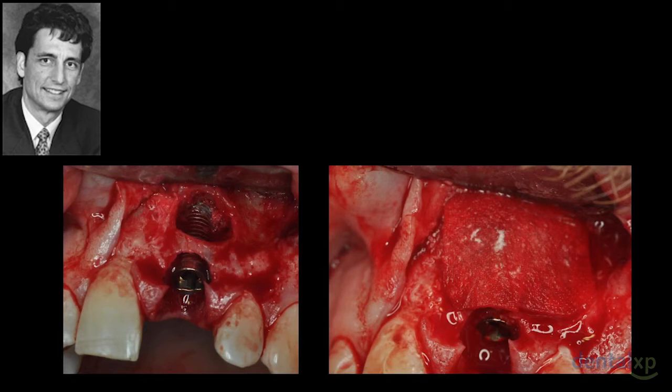It is also feasible to try to tunnel or to use a semilunar incision down at the periapical region, which I have done, but sometimes in these very large defects, I find it difficult to clean that defect out thoroughly, and therefore I feel I still have a better result if I go ahead and flap it to clean that out. Now, I'm using an incision design that is sparing these papilla because that's the most difficult, is to try to preserve those papilla for maximal aesthetic outcomes.